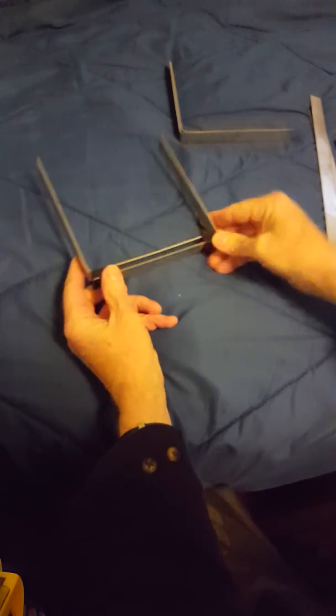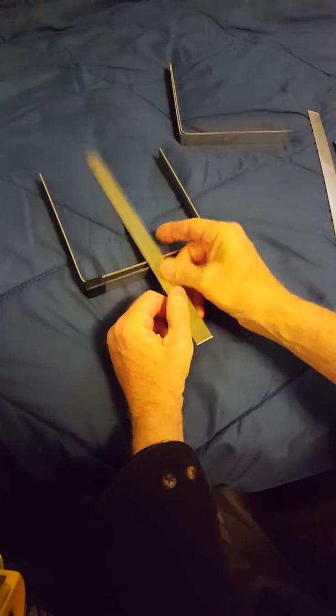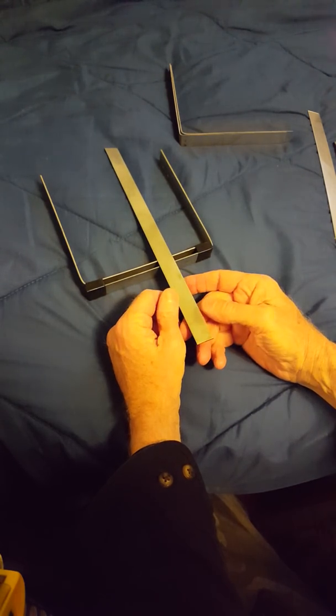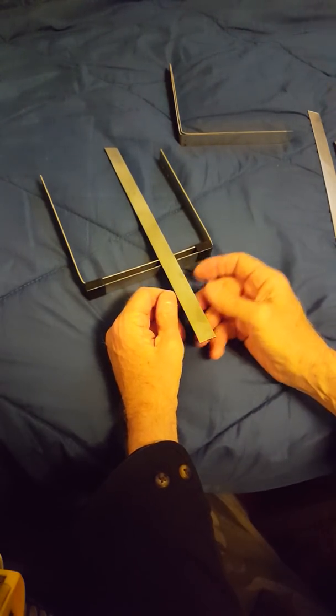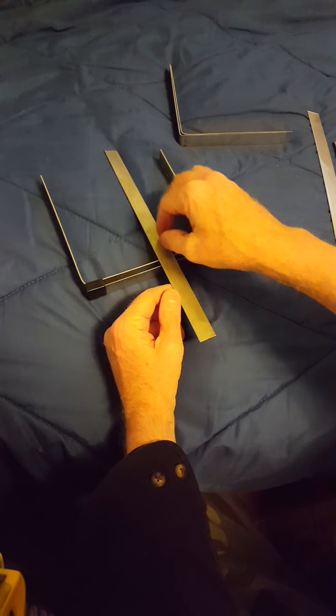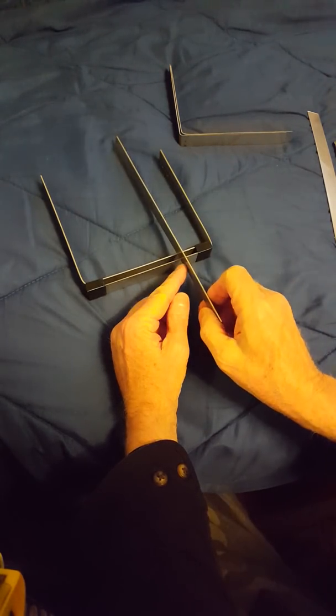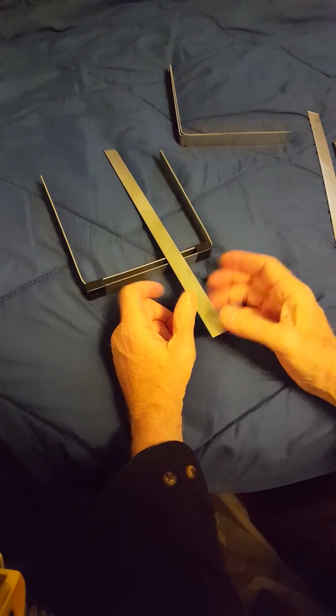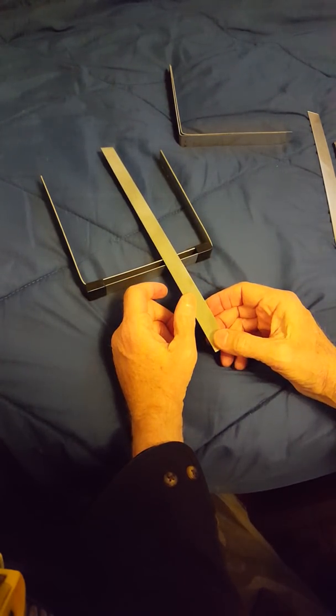What I do is I go to my local steel dealer, and I just called this last order in. I said I want 304 stainless steel. I wanted a foot long, 1/16 inch thick, 3/4 inch wide, and he just stamped them out for me. So I got a bunch of them that way.